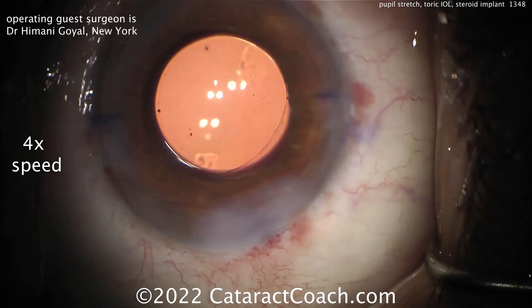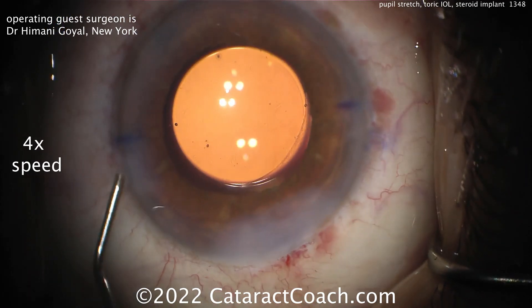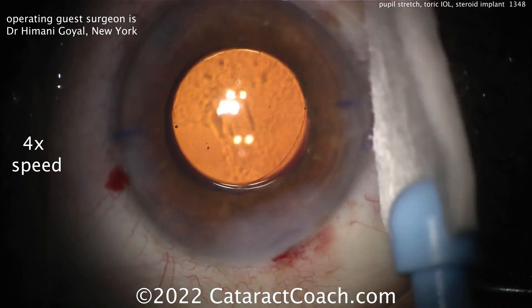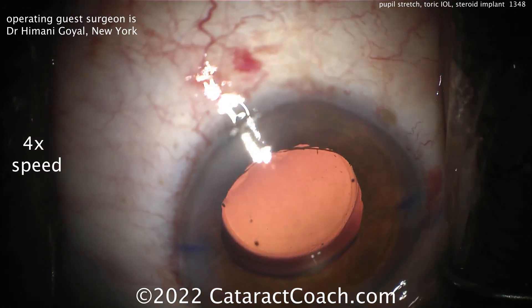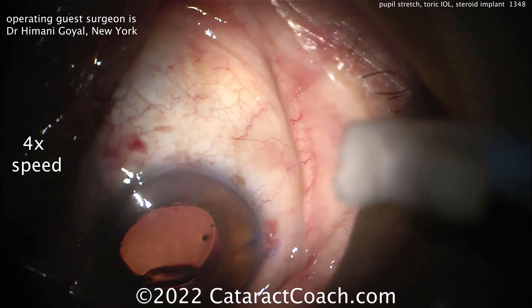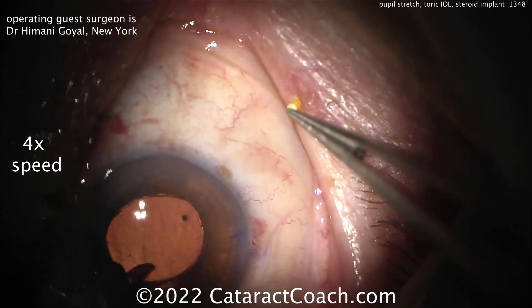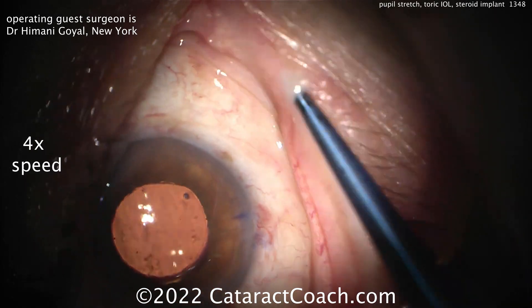Very nice case. A little more hydration, and checking the paracenteses as well. I like the position — incisions look nicely sealed. In the U.S. we have a couple of options for these steroid implants. DexEQ is placed behind the iris inside the eye in the posterior chamber. This one is Dextenza, placed in the inferior canaliculus. Still using the microscope, dilating the punctum a little bit. Here comes the implant — pushed in there. It's in a matrix that will dissolve. If it's still a little tight, you may have to dilate it up a little more.